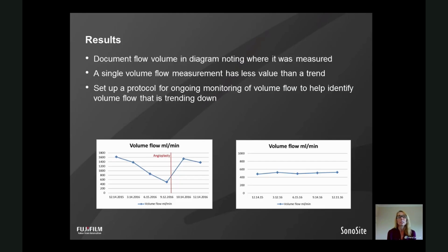Because I think particularly if you're doing an outflow vein that we know is only 1 lumen of 2 lumens. So, in the median cubital, you're measuring the basilic outflow limb rather than the cephalic limb. So it's important to document where you are measuring them.